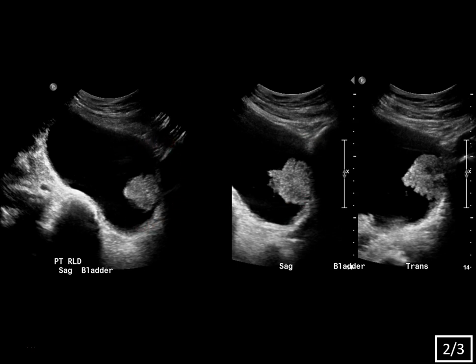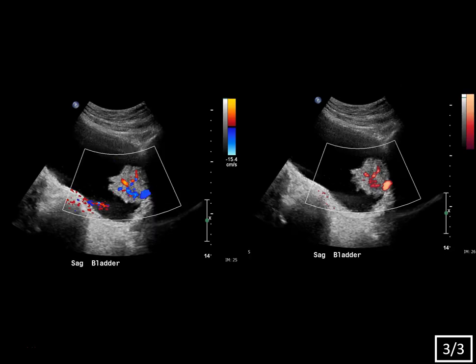That's one of the great things about ultrasound — it's such a dynamic modality. Whenever you see a bladder mass, you should have the patient roll, and if it changes position, it's a clot, or it could be a pedunculated neoplasm, but this is staying fixed to the wall, typical for a neoplasm.